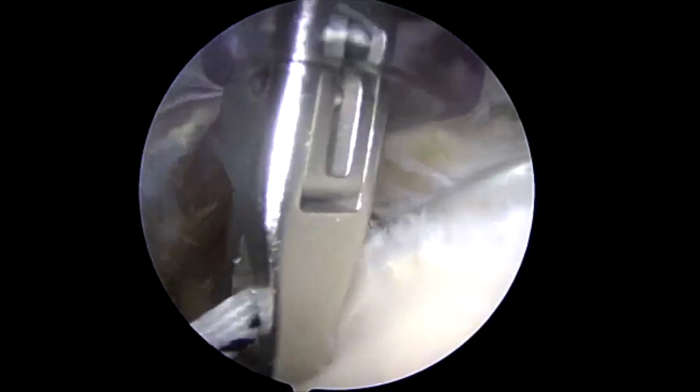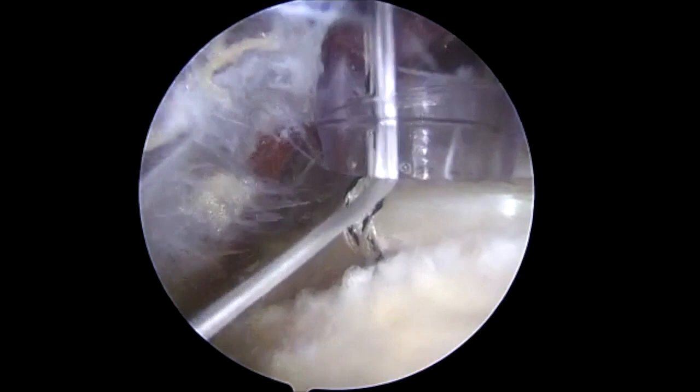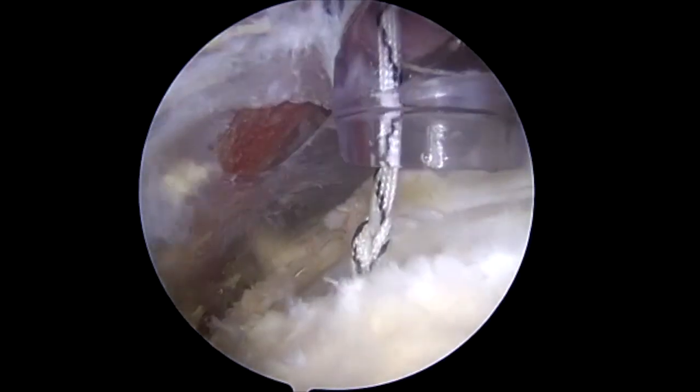The suture is removed from the anterior portal and used to elevate the biceps tendon.